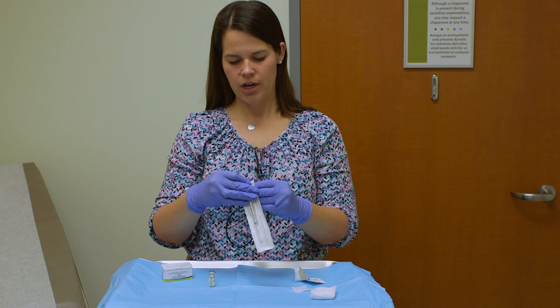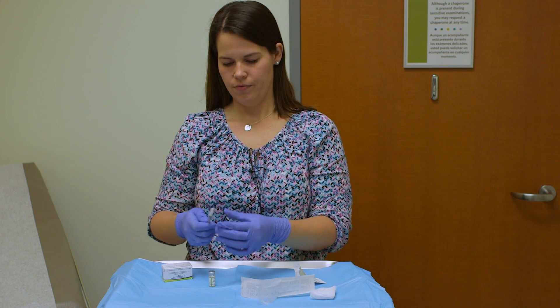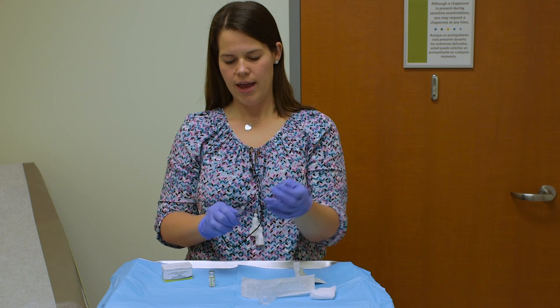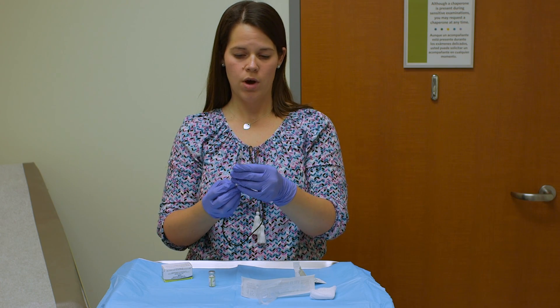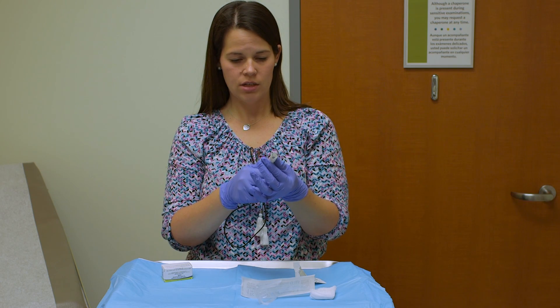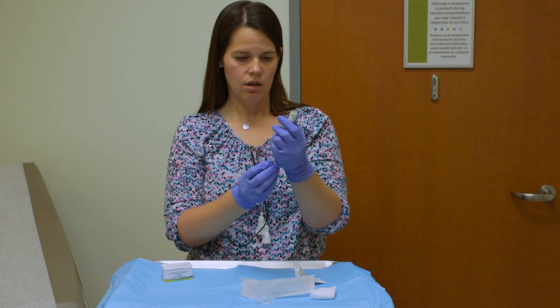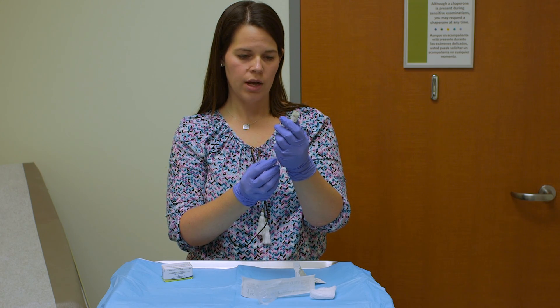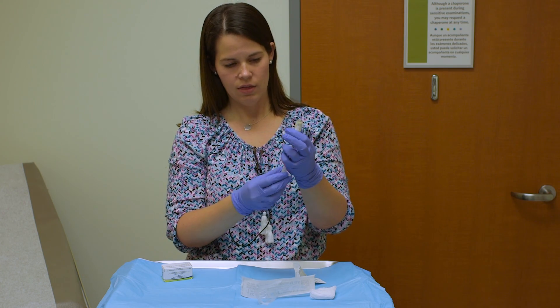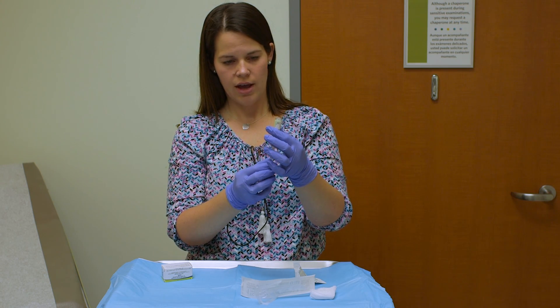Next, take the syringe out of the package. Make sure the needle is on tight and uncap it. You're going to draw 0.1 of air, then place that needle into the vial and push in that air. Draw out the tuberculin 0.1. If there are any bubbles, just flick it to get the bubbles out, then take the needle out of the vial.